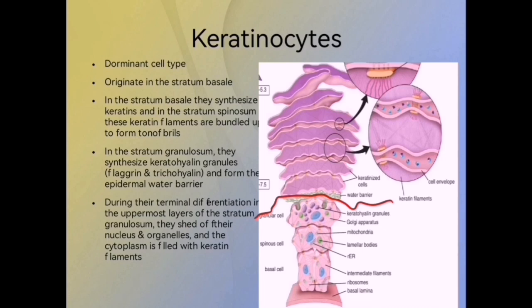These cells accumulate keratin filaments within the last two layers of the skin, the stratum lucidum and the stratum corneum. These keratin filaments fill out the cytoplasm and give the cells a characteristic eosinophilic appearance. These cells are squamated. As you can see, they are squamated cells.